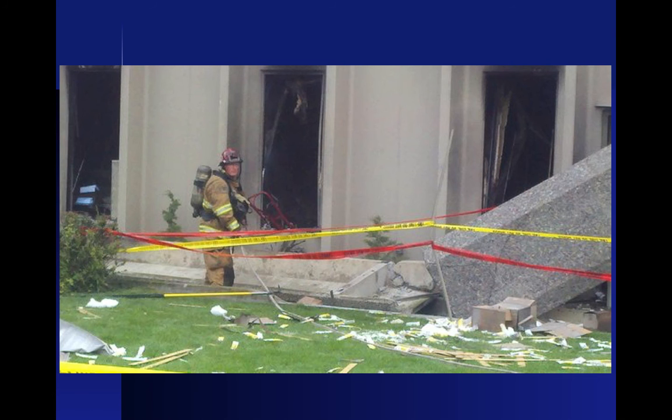Real mess. Now, earlier, about 2 years ago in Spokane, Washington, there was an oral surgery office. One of the staff members came in and noticed a strange noise, and she alerted and got everybody out of the office, and the tank room blew. Something was going on in the tank room, and it ignited the nitrous and something that was combustible. The tank room shouldn't have anything combustible in it, and it blew the side out of the building.